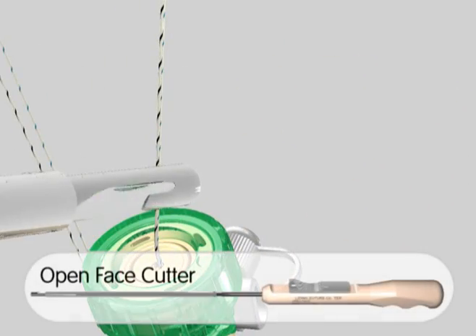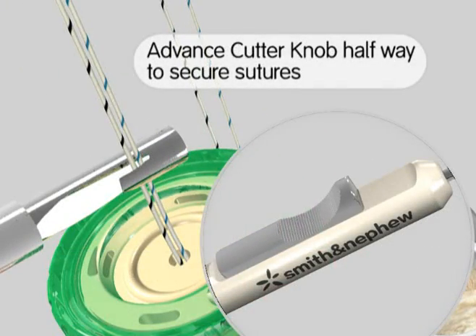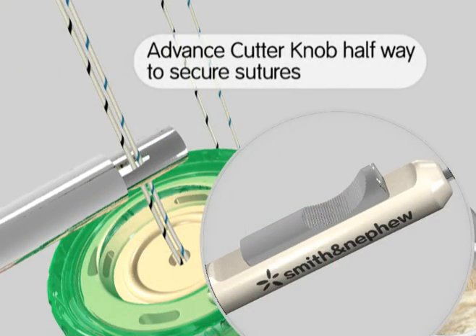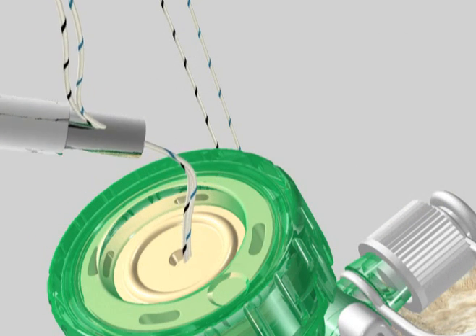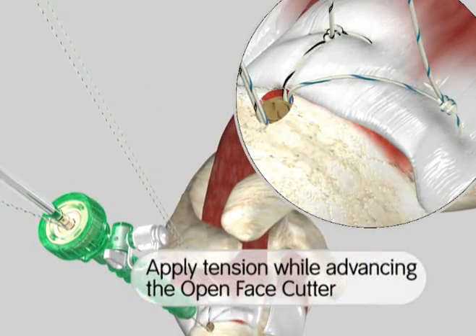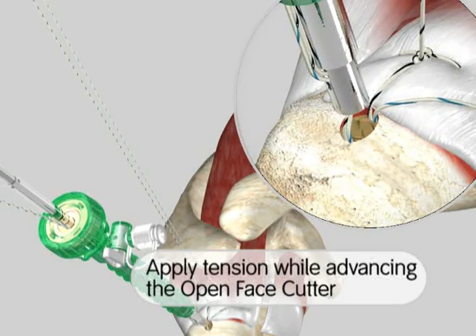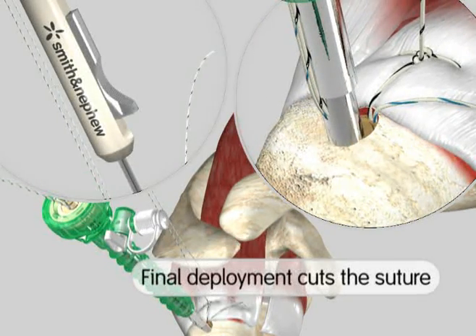Shown is the open-face suture cutter that can be loaded outside or inside the joint. Partial deployment of the device secures the suture within the cutter and the cutter is advanced into the joint. Final deployment of the device cuts the suture with a short tail.